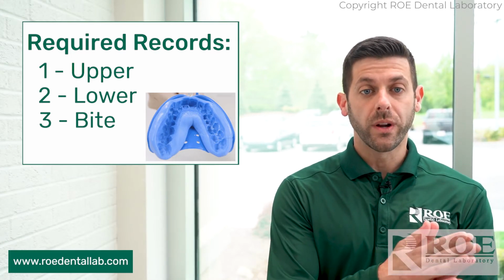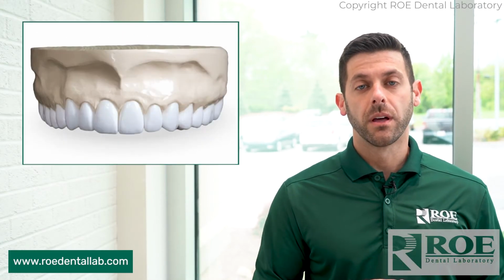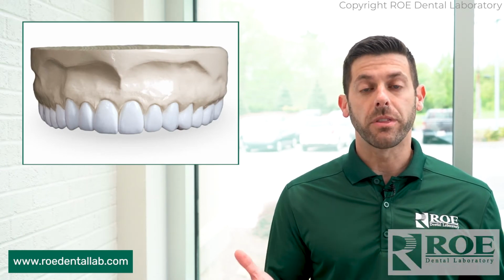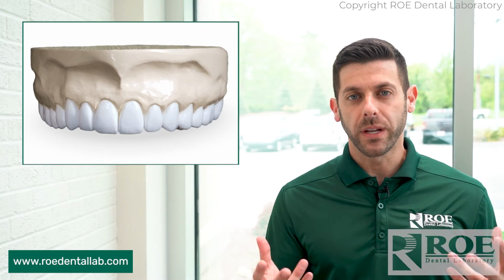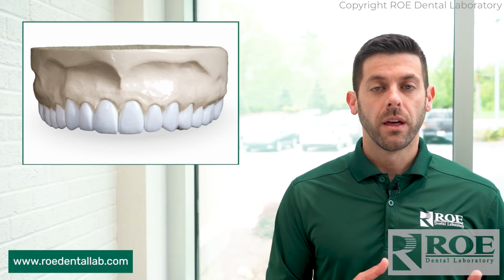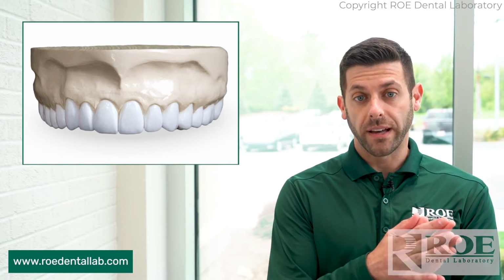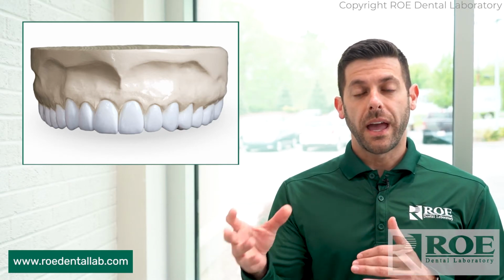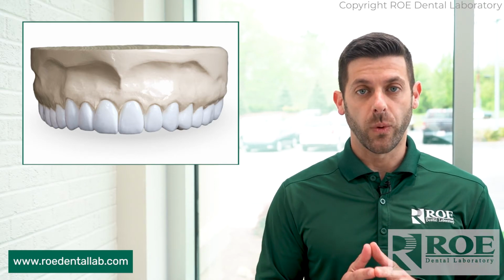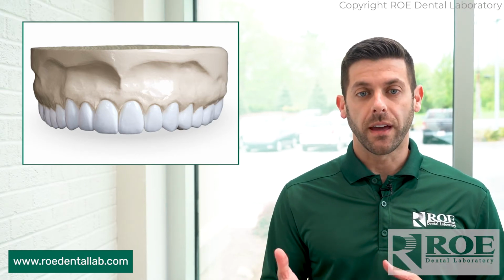From there, we're going to send you a digital wax up. Now, this is going to be obviously the wax above their new teeth, so you can sit down with the patient again and have them kind of re-buy in on their new look. If there's any changes, let us know. The nice thing about the digital wax up is you can keep that as a follow it when you're prepping the teeth as well. You can refer back to that.